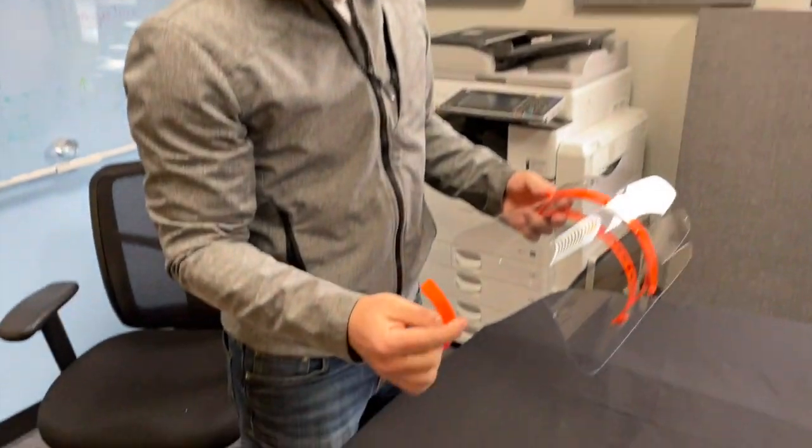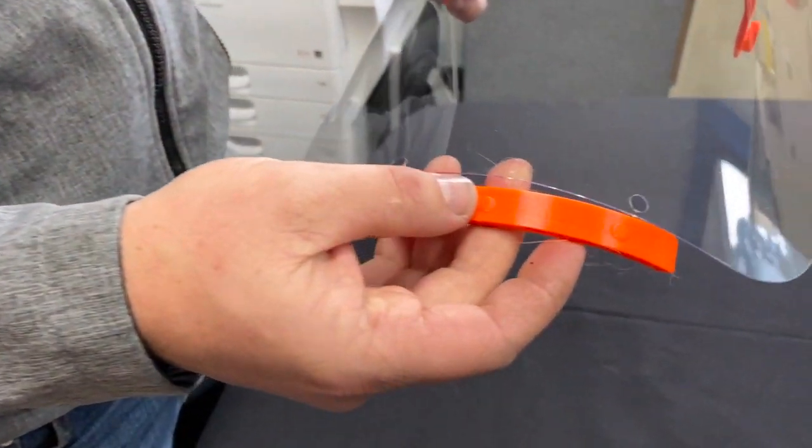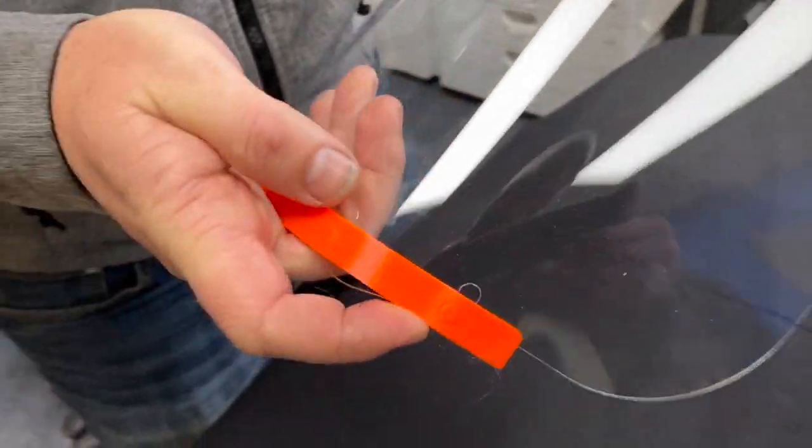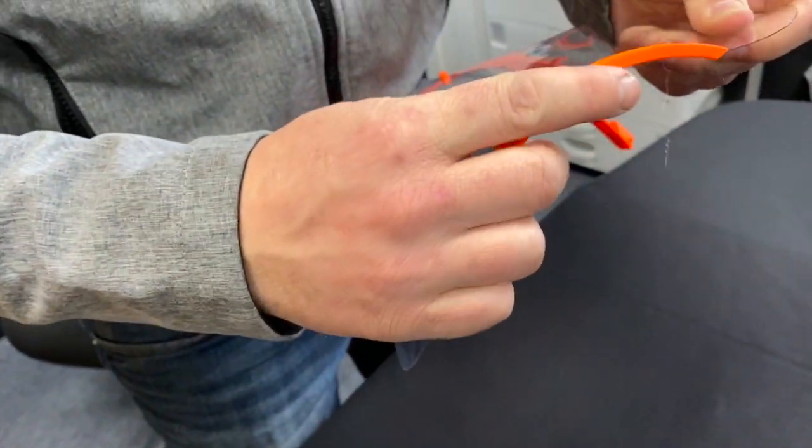Take the bottom stabilizer and align the pins with the holes in the face shield and press that into place.